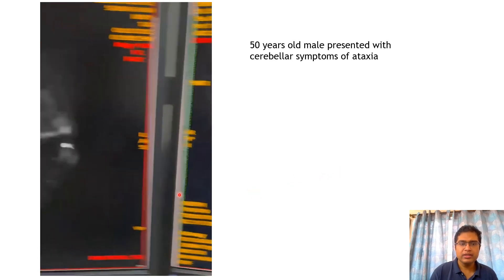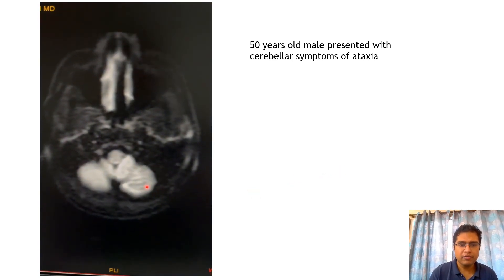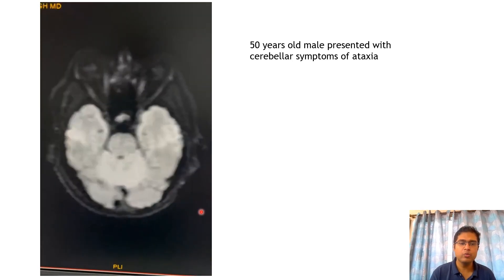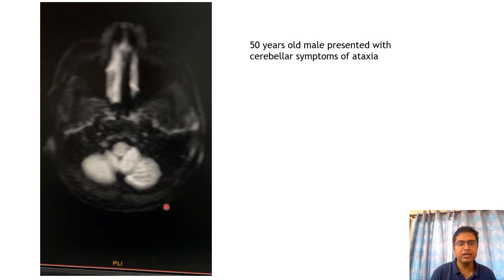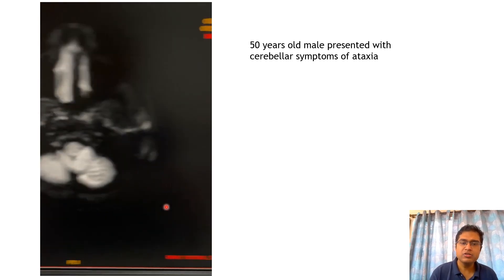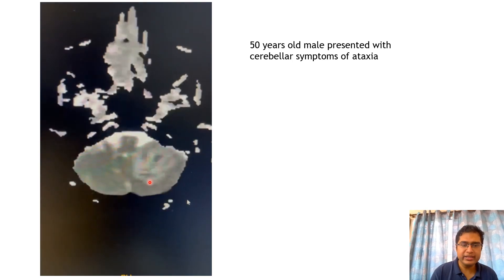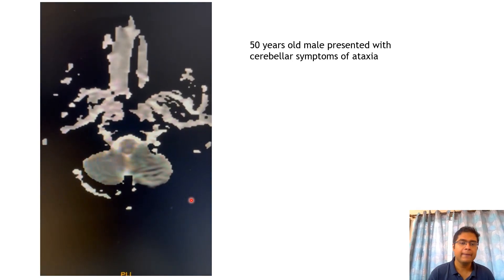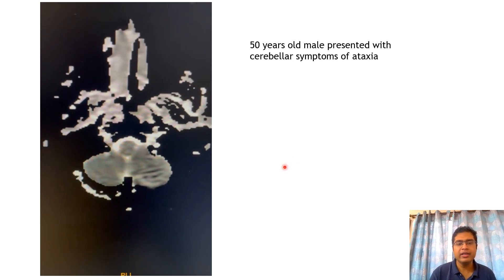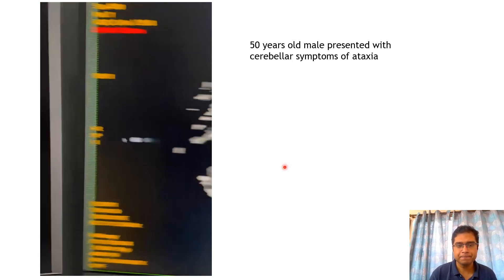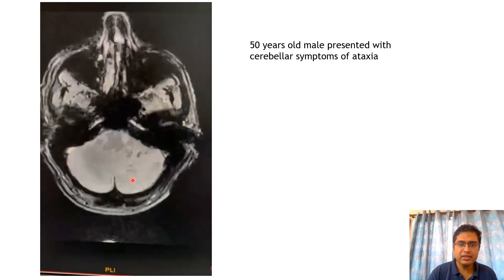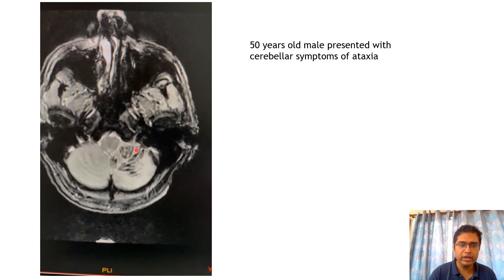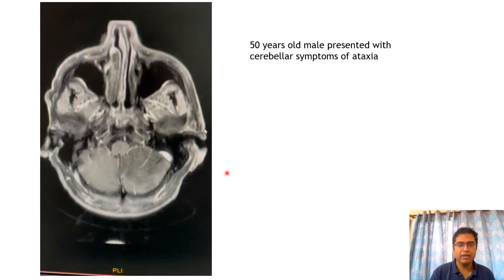On DWI images, there are hyperintense areas within the lesion. There is corresponding subtle hypointensity on the ADC map, suggesting areas of restricted diffusion within the lesion. On axial GRE images, we can see intense blooming of the folia in the left cerebellar hemisphere.